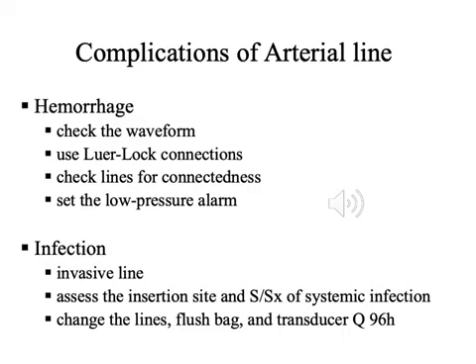The connection should use a Luer lock connection to prevent it from becoming loose. We always need to make sure the stopcock is connected and not loose to prevent hemorrhage. If, for example, the arterial line area is not exposed, like the femoral, keep checking the sites every time and make sure there are not even hematomas.